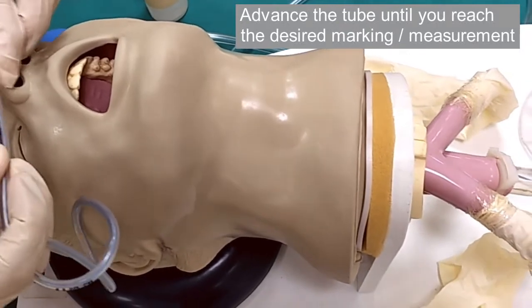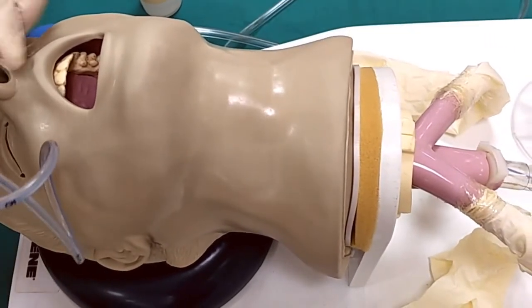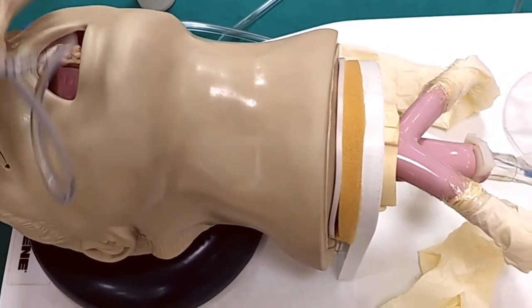In this mannequin, you can see the tip of the nasogastric tube as it advances into the gastric cavity. Normally, you would not see this in a live patient.